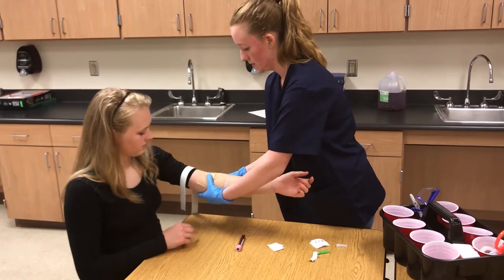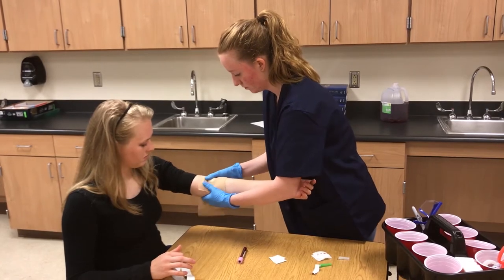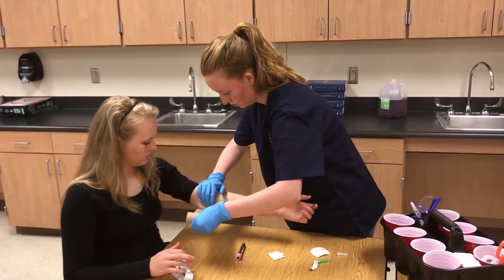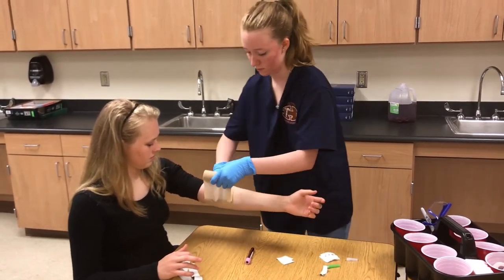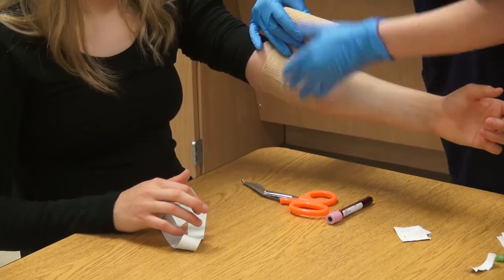'Could you lift up your arm, please?' 'Is it too tight?' 'No.' Using your scissors, cut the wrap.